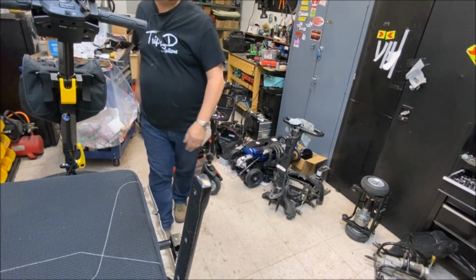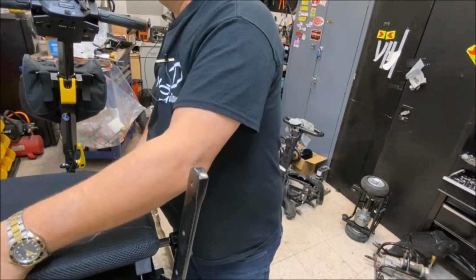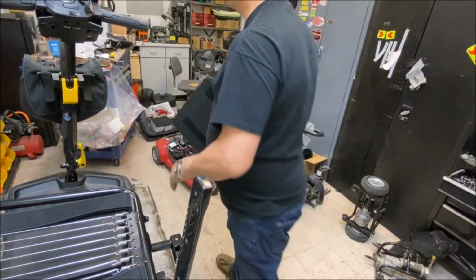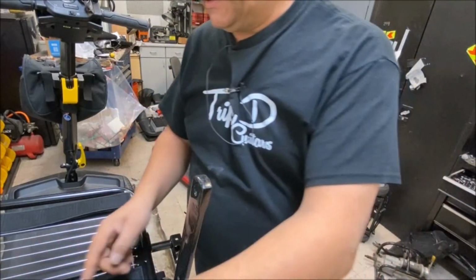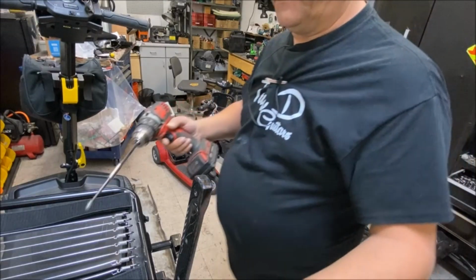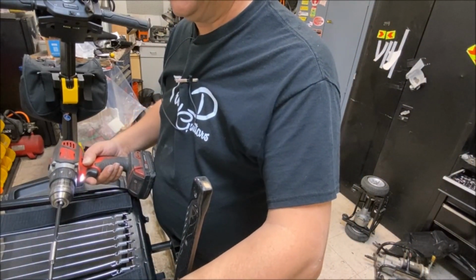I can move on to removing the seat cushion and then start looking at where the bolts attach to the frame of the scooter to remove the rest of the backrest. Let's just go through it pretty slow and see what bits I need and what bits I don't need.